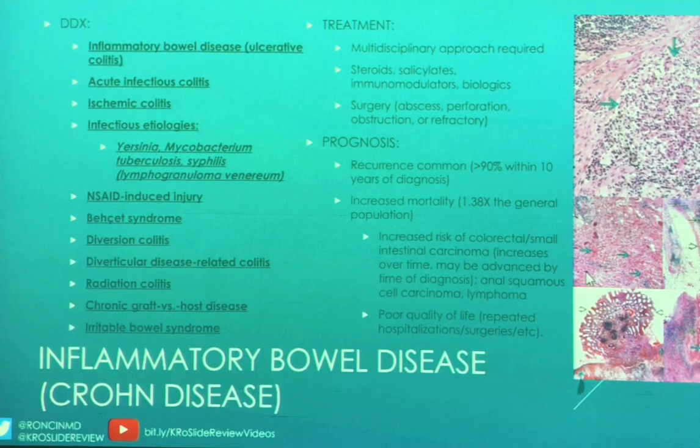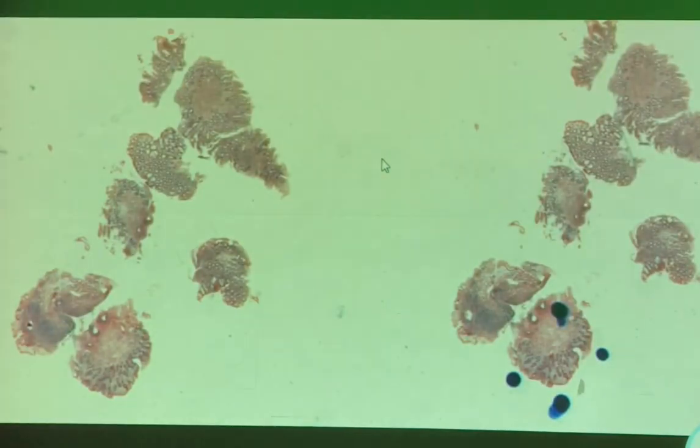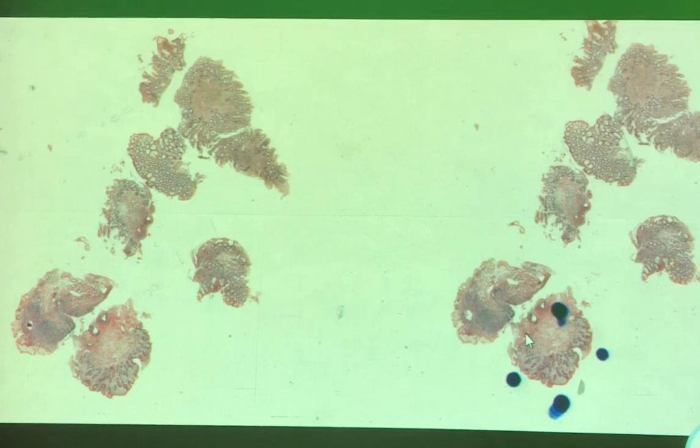Some of the other things that we're looking at here, so this is one of those pseudopolyps. This is showing a fissure. So your fissures will always be sharp and knife-like. This is showing creeping fat here. Okay? This is case 8. And again, they left us some extremely helpful docs. So we're just going to take a look at those.